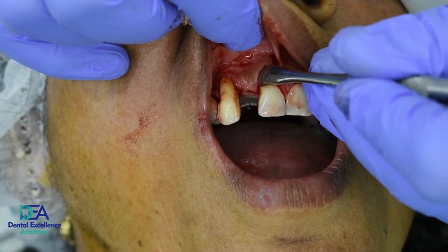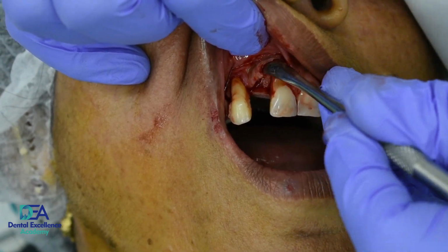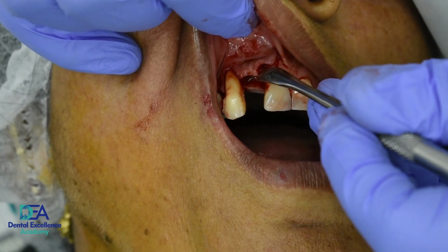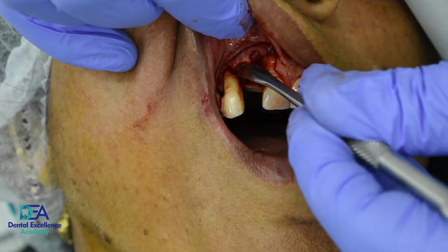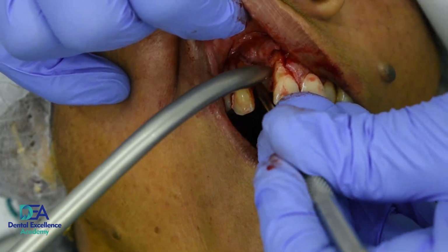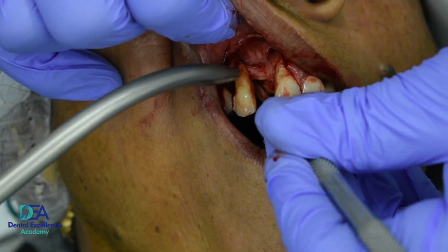So we'll be starting with the reflection of the flap. You have to have a good instrument, a sharp periosteal elevator, so that you can reflect it properly. So now I'm reflecting the palatal flap.